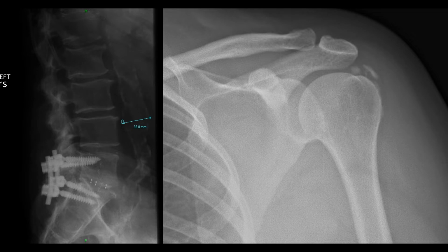Soft tissues is the last major category, so we're just assessing pretty much all of the organs and skin and whatnot. So looking here, on the left, we're seeing what looks like a bony structure in front of the spine that we wouldn't expect. In this case, this is a calcified abdominal aorta, and that is something we do not expect and we should comment on. On the right, again, we've got some more calcific or bony looking mass or structure that we're not expecting to see.